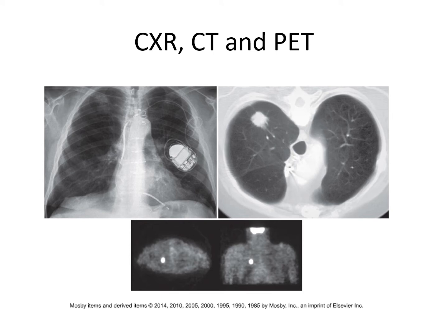It'll usually look clear on the x-ray, but tumors and areas of infection have an increased rate of metabolic activity, and so that causes these hot spots. So the spots that are white there on that PET scan on the bottom view, those are the hot spots. They often will use CT and PET scans simultaneously and then look at the images superimposed on each other to help diagnose.